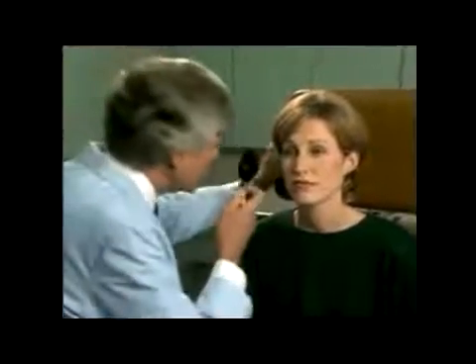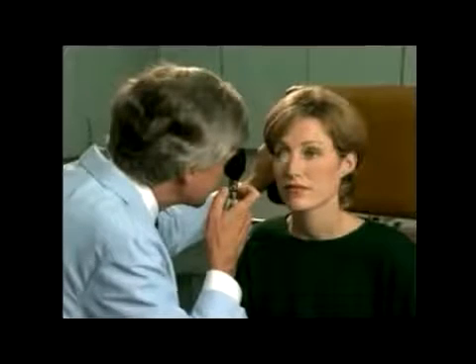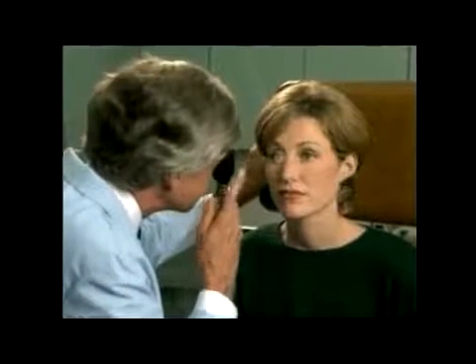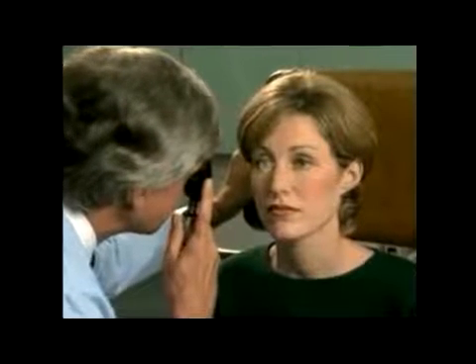Ask the patient to look straight ahead at a distant object as you position the ophthalmoscope about 6 inches and 25 degrees to the right of the patient and direct the light beam into the pupil. A red reflex should appear as you look through the pupil.